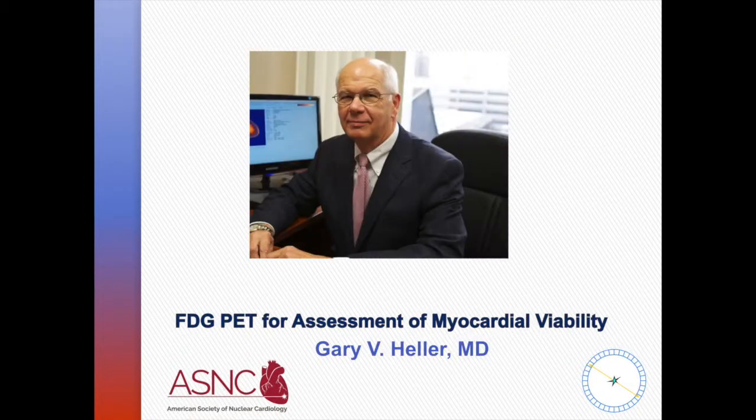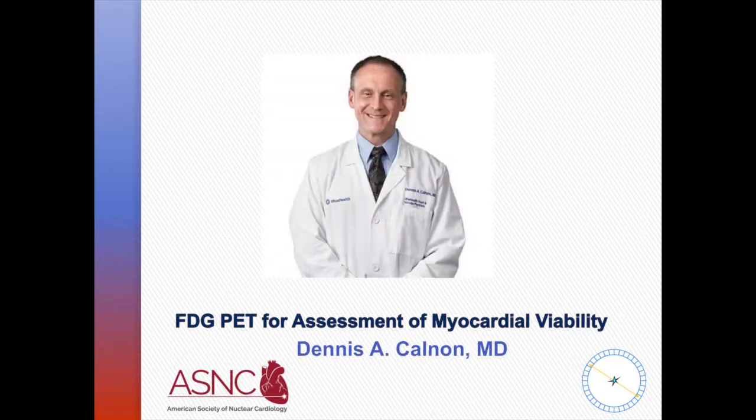That's terrific. Let me ask you a couple of questions. First off, if you're in a situation in which you're not doing either ammonia or rubidium PET, can the ischemia workup be done with SPECT rather than with either of these PET tracers? Yeah, absolutely, and that's a very good point.